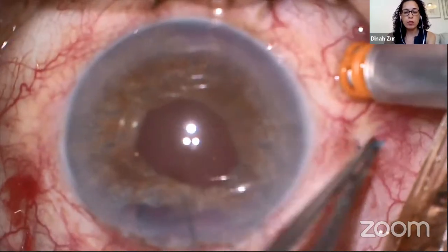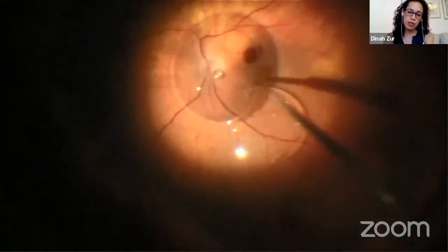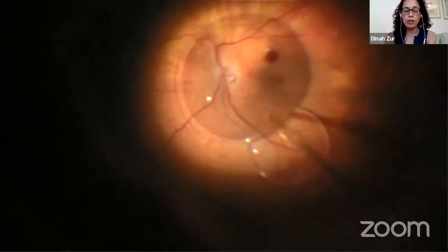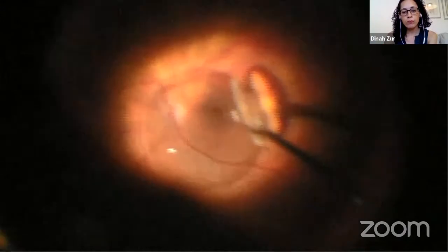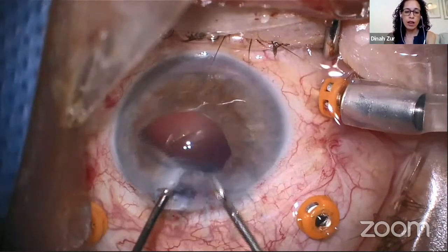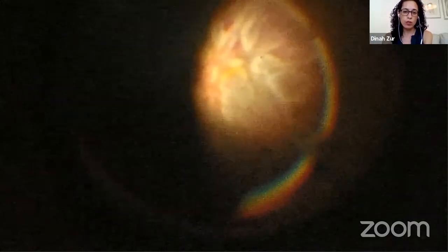Of course, we need to pull them out and also do a vitrectomy because the optic fell down to the vitreous cavity. You can see here as we raise it, and then extract the intraocular lens. You have to enlarge the incision. And of course, we don't want to see late complications such as late retinal detachment because of the traction we caused during the primary surgery.